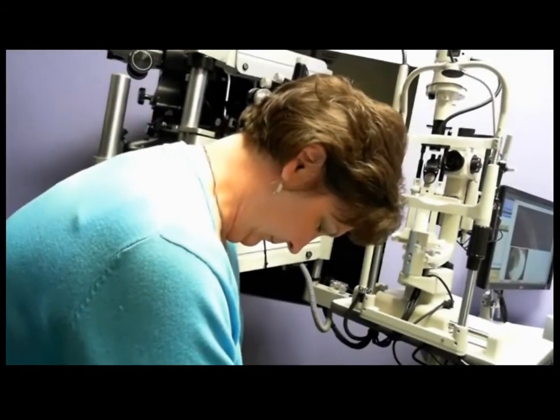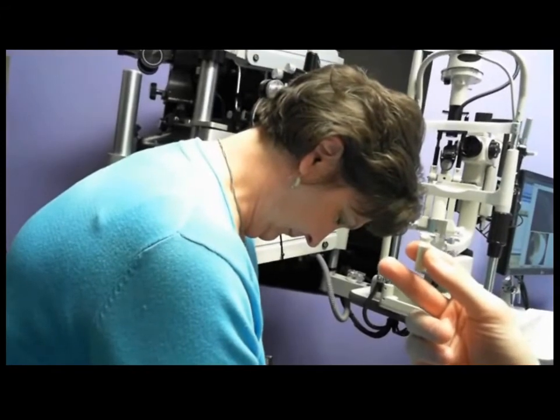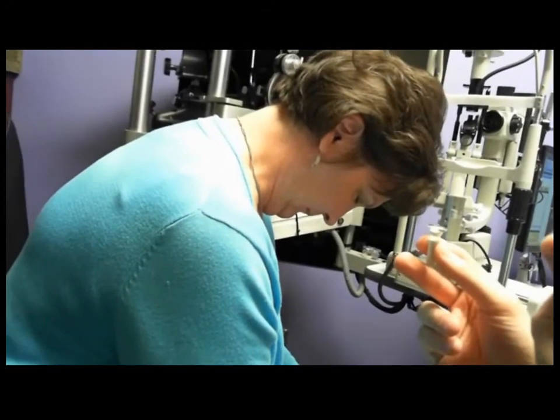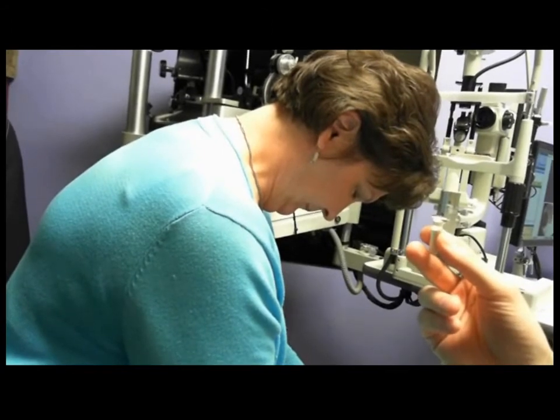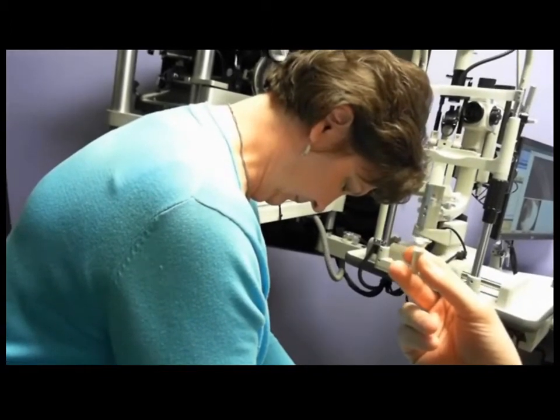So what I'm going to do is take the lens, and my middle finger is going to pull down her lower lid, and with my other finger, I'm going to pin the upper lid against the maxillary bone. That's the superior orbital rim. That's one of the dangers of doing things live, is you use the wrong words. And get them out of the way so that you can get a lens on.